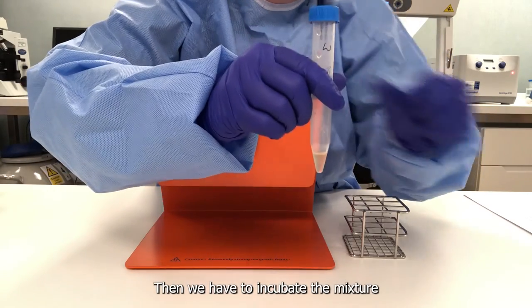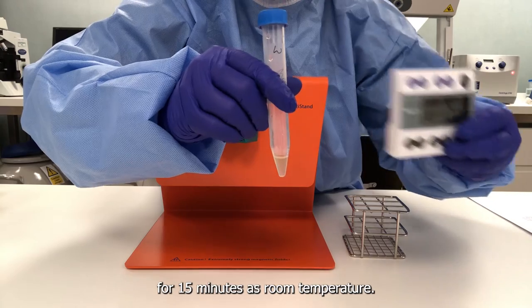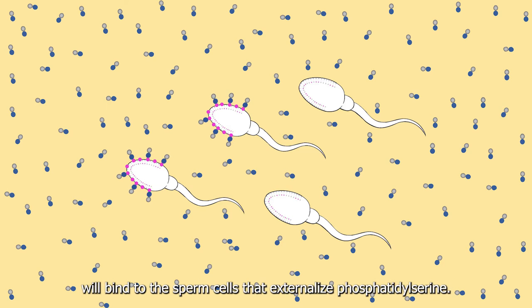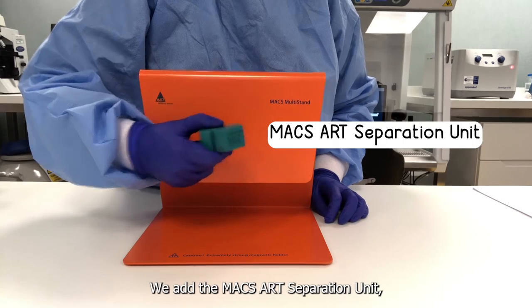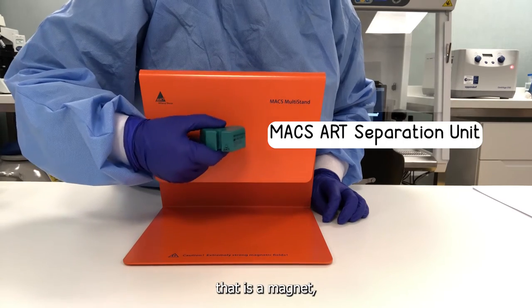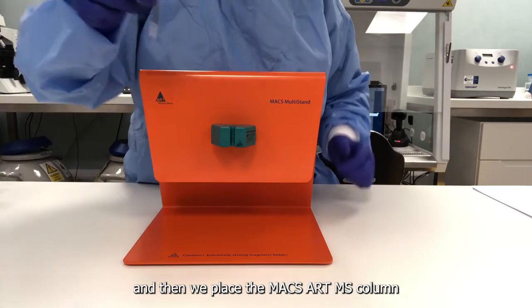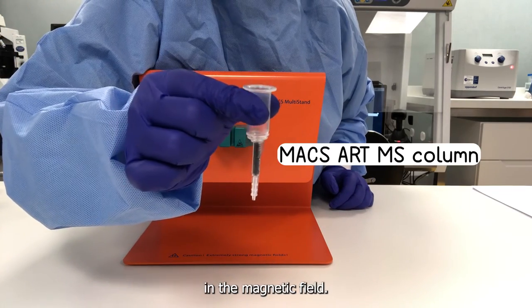Then we have to incubate this mixture for 15 minutes at room temperature. The magnetic microbeads conjugated to Annexin-5 will bind to the sperm cells that externalize phosphatidylserine. We add the MACS-ART separation unit — which is a magnet — to the MACS Multistand, and then we place the MACS-ART MS column in the magnetic field.